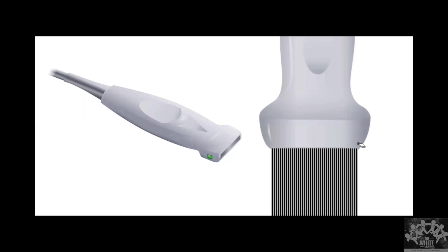Imagine if the patient is too small, if it is an infant, then you can use the linear probe alone. The linear probe itself will penetrate deep enough that you can see the entire abdomen. That's how you decide. The probes are given with different frequencies. You see the frequency and you see what depth you want to see in the patient, and based on that, you decide whether to use a linear probe or a curvilinear probe.